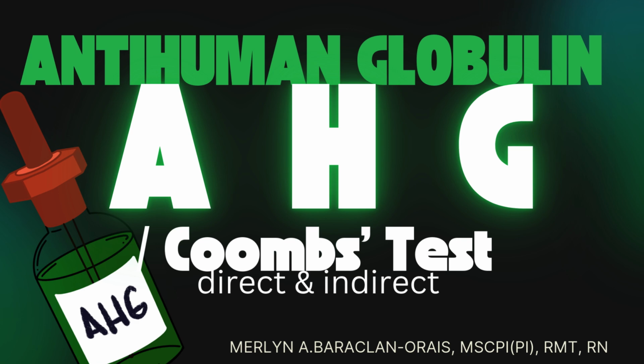So we will explore the anti-human globulin test, commonly known as the Coombs test, which plays a vital role in medical diagnostics, especially in immunohematology. To begin, it is essential to distinguish between two primary types of these tests: the DAT, the direct anti-human globulin test, and the indirect anti-human globulin test, or IAT. The direct test identifies antibodies that are already attached to the surfaces of red cells, making it particularly valuable for diagnosing conditions such as autoimmune hemolytic anemia.